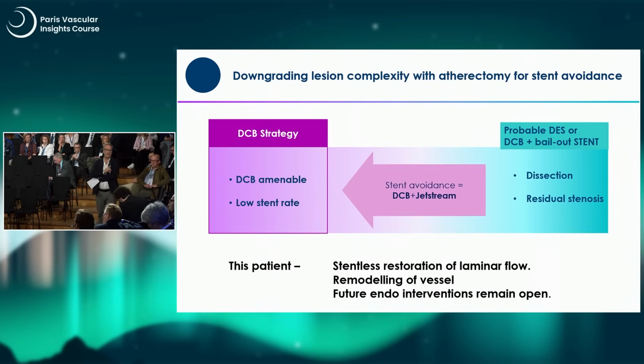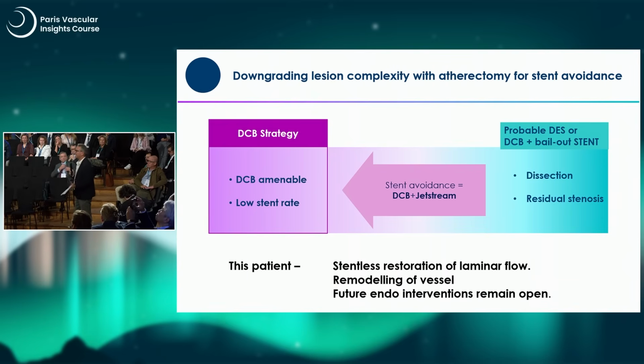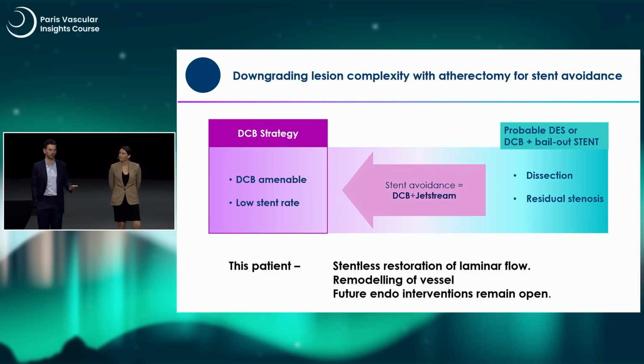Yeah, of course. Once again, this is nonsense. What you mentioned, Caroline, is the landing zone for distal or proximal bypasses. We never implant a bypass where we retrieve calcium. But if you have a long dissection below this bulky plaque, then you might end up in one that would be suitable for a bypass. And we know that ISR is also very difficult to treat. So if we can avoid having metal and ISR, then it's going to be easier if you want to treat your patient in a second procedure. This is an extra option for the next time he comes back, because this patient will probably come back. He has a severe disease, so we just keep an option open.